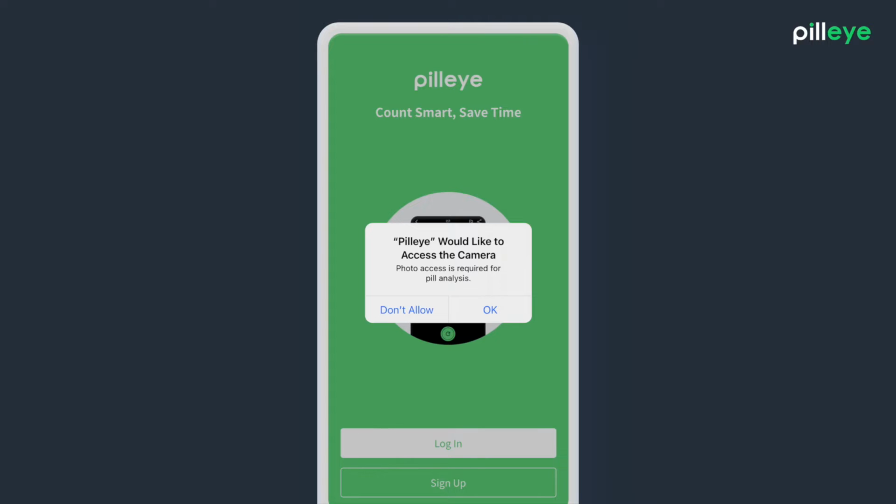On the initial screen, the PillEye app will request access to your phone's camera and photo library. Tap OK to grant these permissions as they are necessary for the app to function. For Android phones, tap Allow and while using the app button to confirm the access grant.